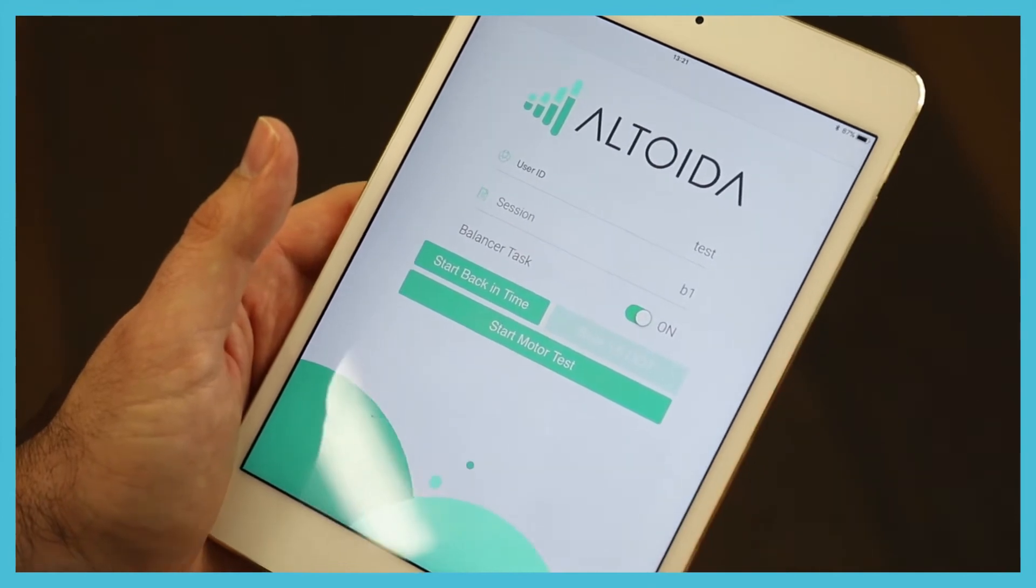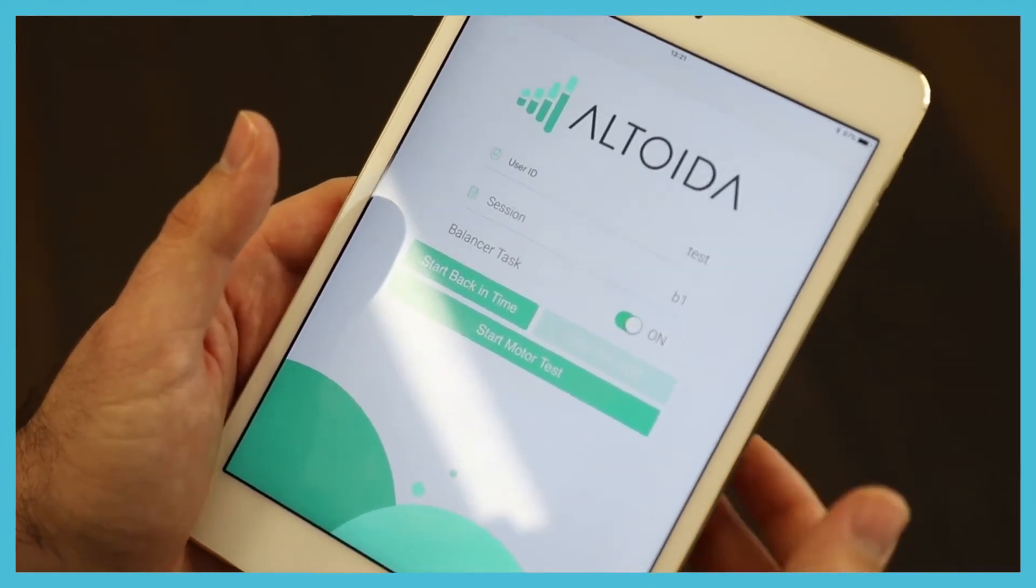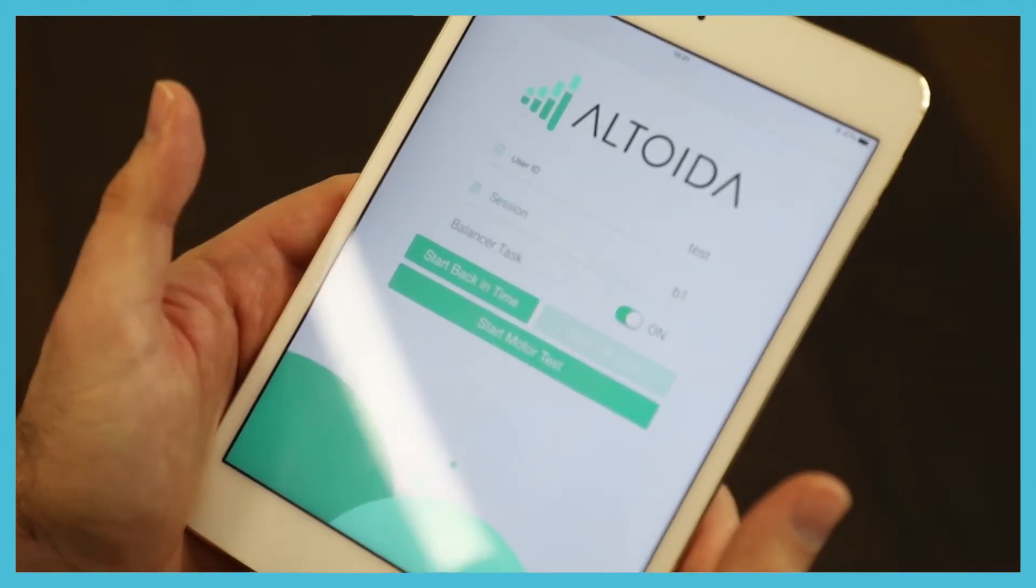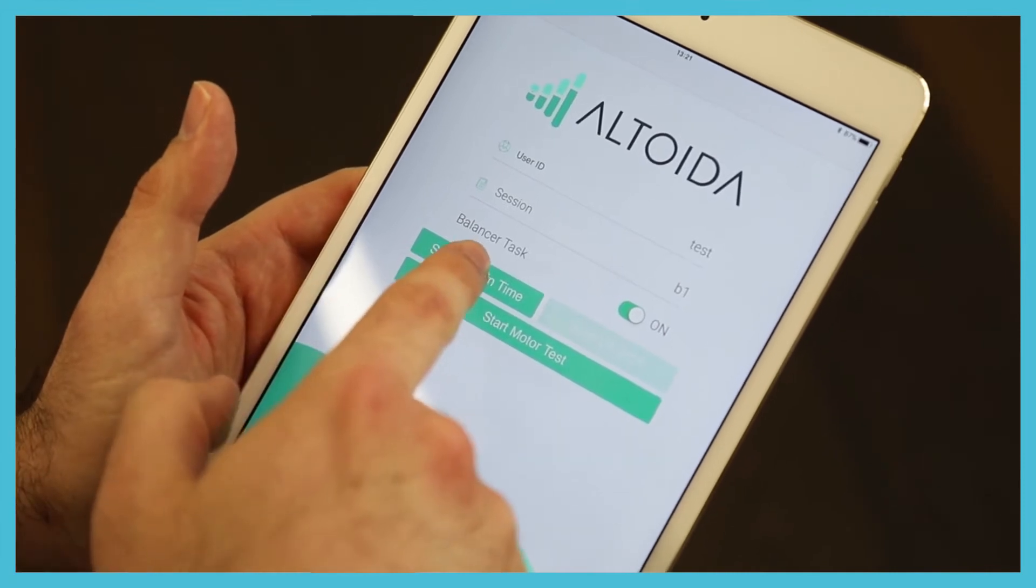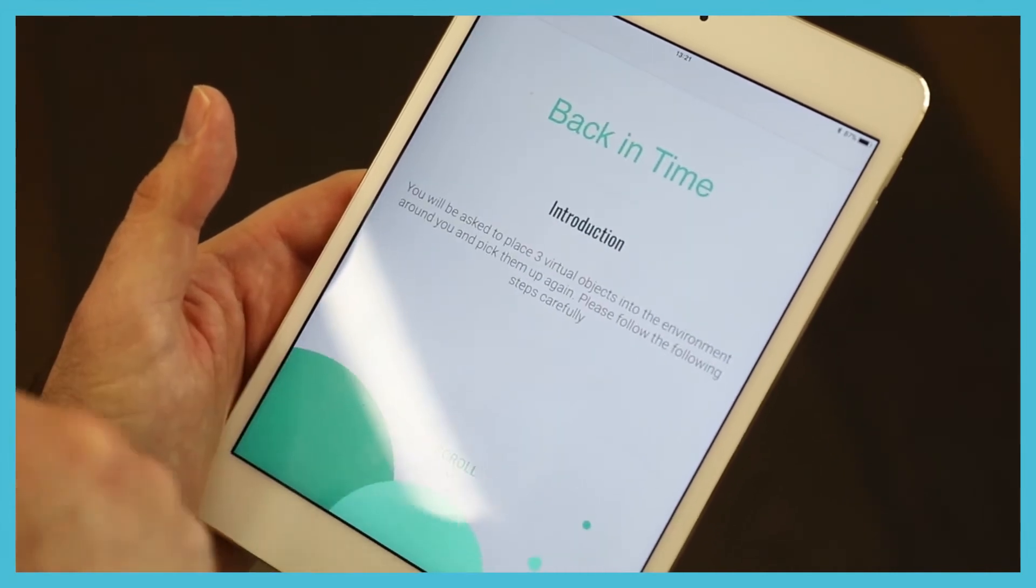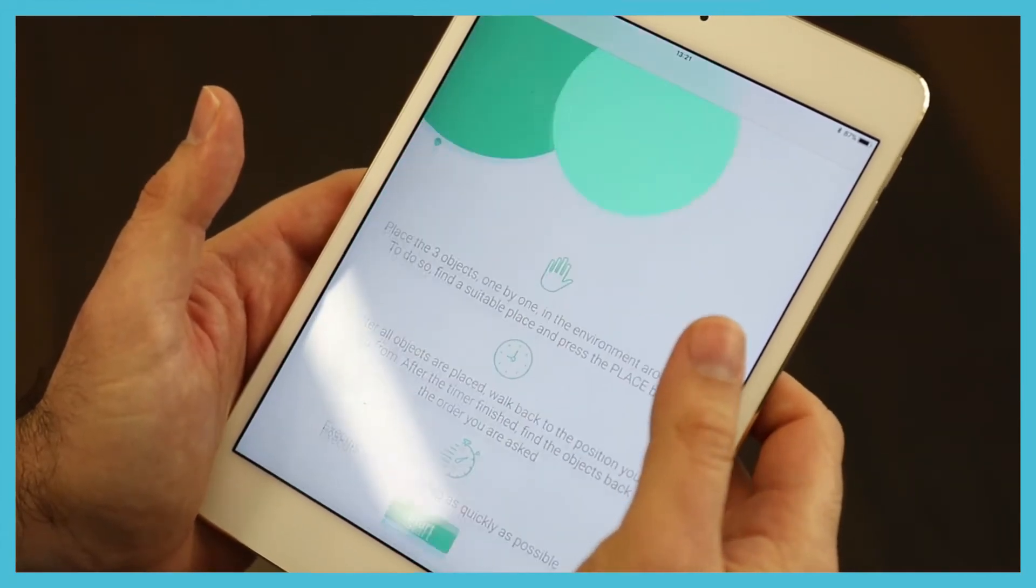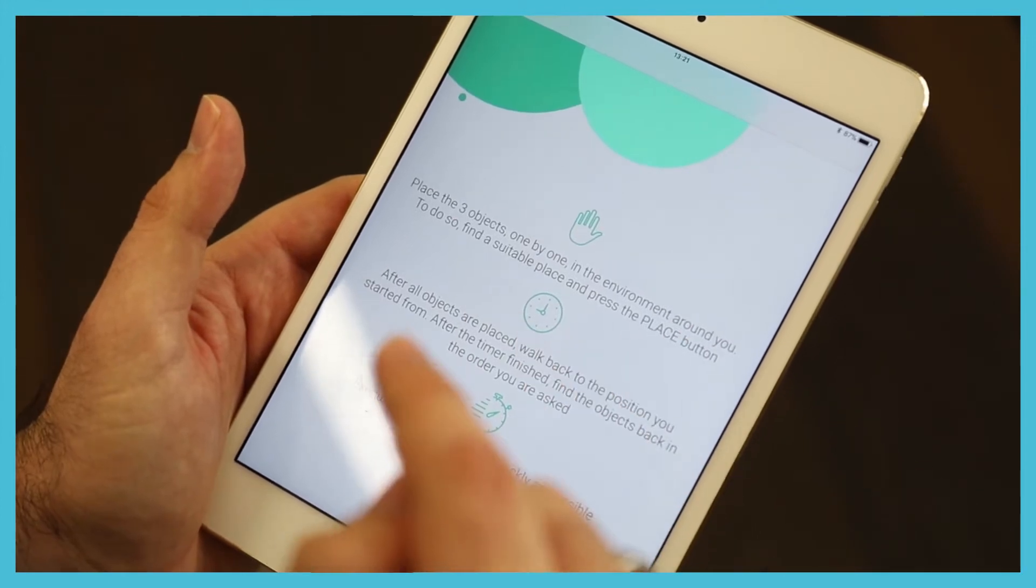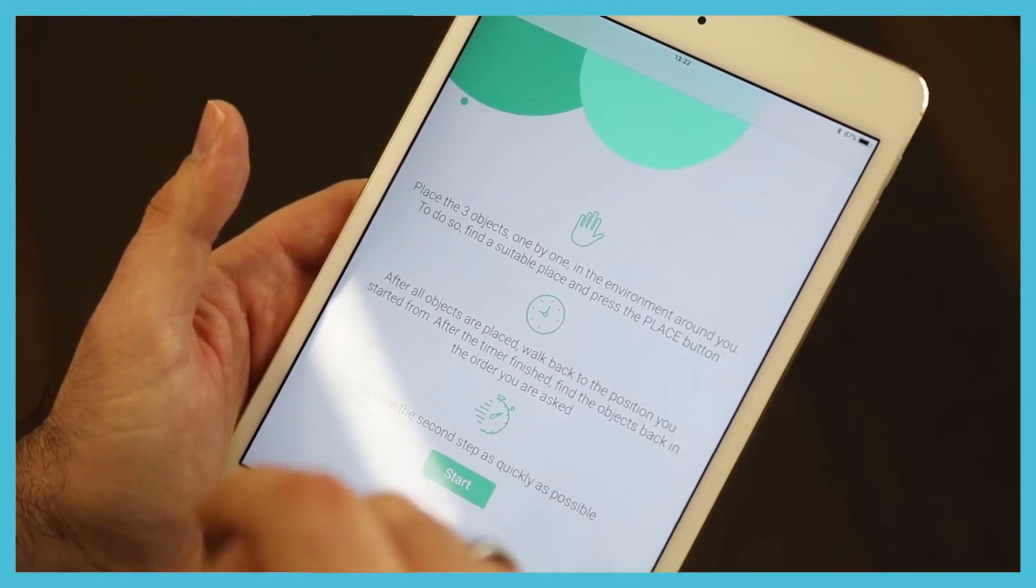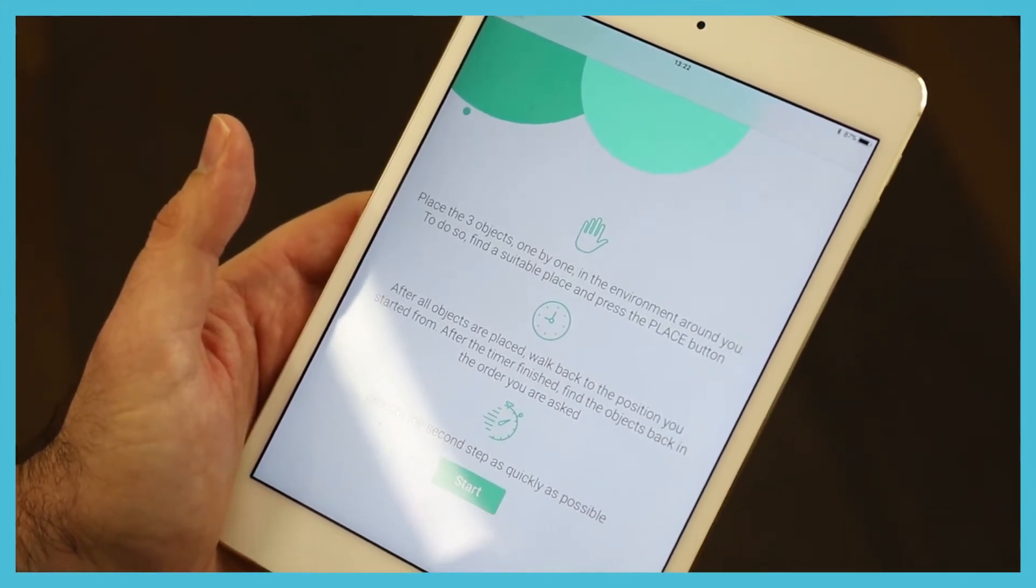Once this is done, I need to stand up and I need to do the augmented reality test. So this is the instructions. I need to place three items in real space and then find them back, quite simple.